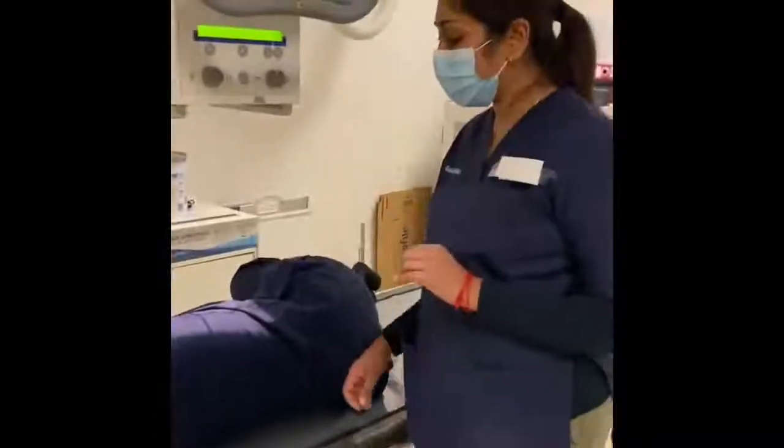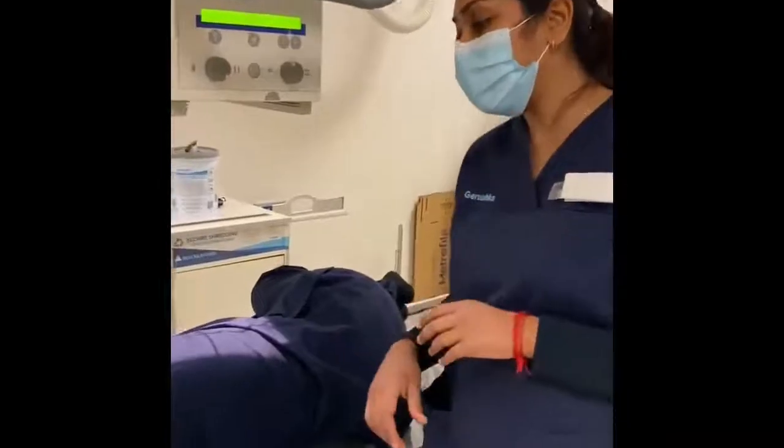Okay, so the centering point for your T-spine lateral is in your mid-coronal plane, midway between the jugular or sternal notch and the xiphoid process, which should bring you more or less at your level of T7. You could also use the inferior angle of your scapula as another reference point for centering.